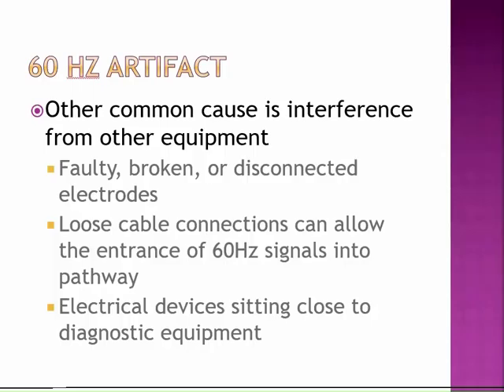What electrical device are they on, or is near them, in their pocket, whatever. I always ask patients to not plug their phones in the same set of outlets that we have our equipment plugged in, because it can and does cause a lot of artifact. Pay attention to that.